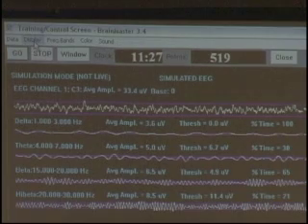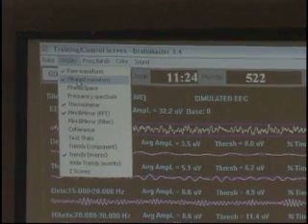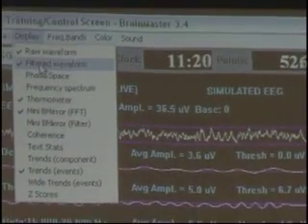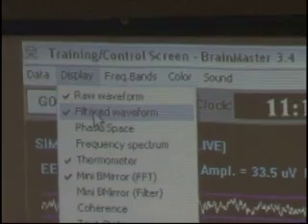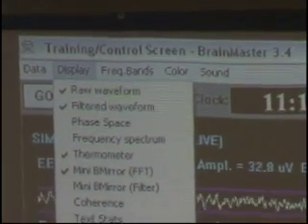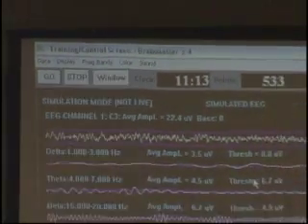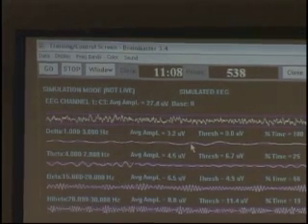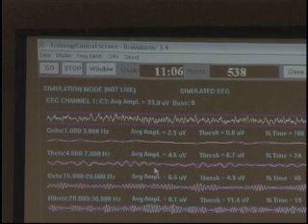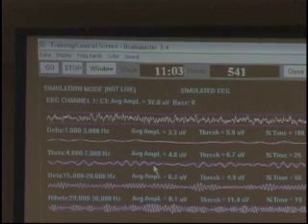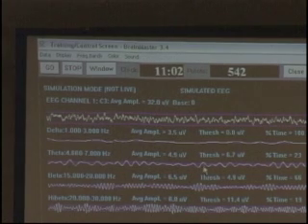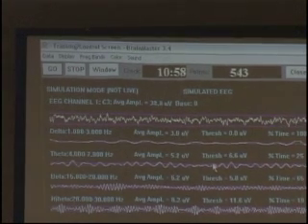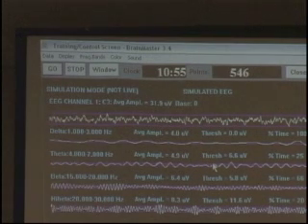Go up to the word 'Display' and click 'Filtered Waveform.' Now I see one line through Delta — I know I'm ignoring it. When I look at Theta, I see two lines, but Theta is a stop, so the goal is to get this white line between those two lines. As my thresholds change, the width of those two lines changes with it.